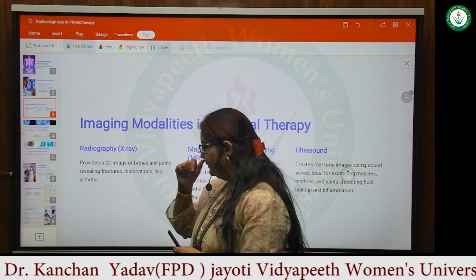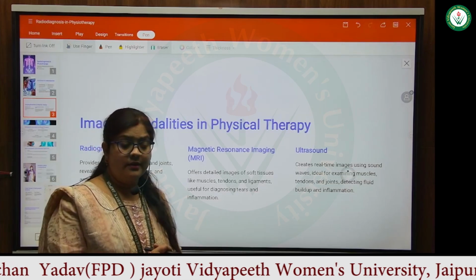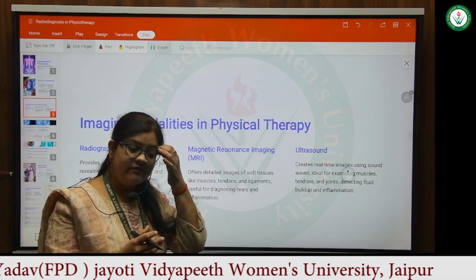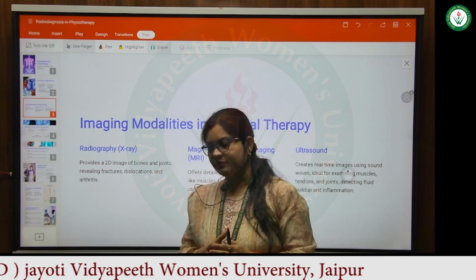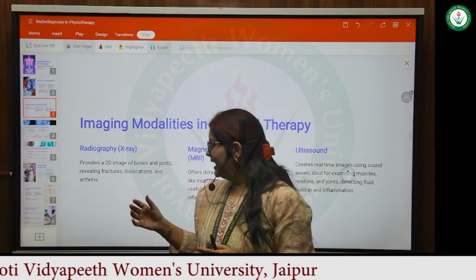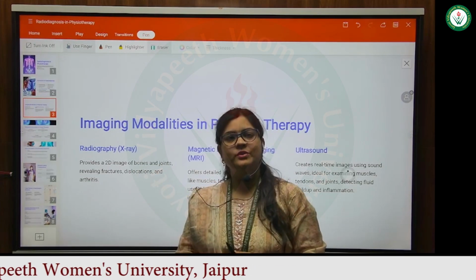Radiographic X-ray is very common because it is easily affordable by everyone, and it is the film which we get, as compared to CT and MRI. We can get this in a short period of time, as it provides a 2D image.